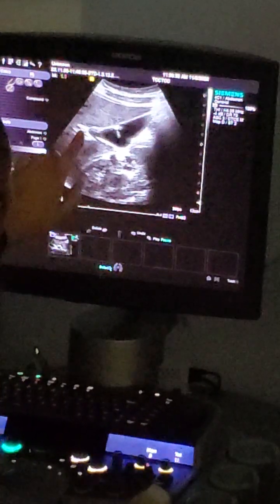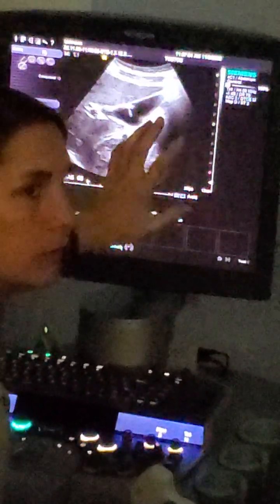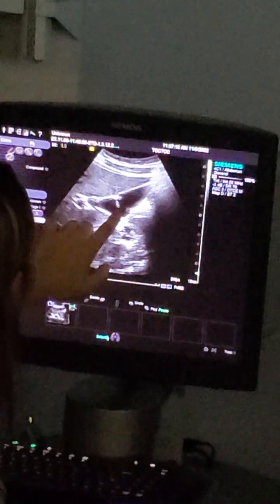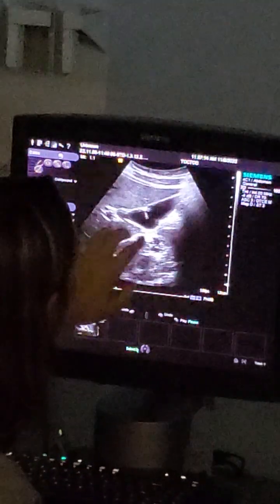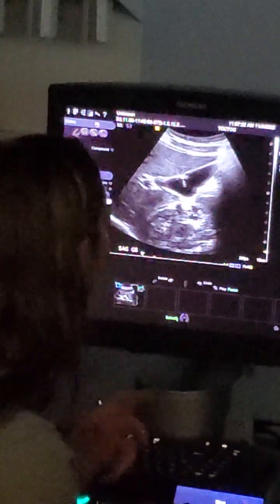So we've got right portal here, not really seeing the main lobar fissure very well. Neck in here, we've got a little fold, which is called Hartmann's pouch. And then we got our fundus up in here. Not very clean. So if this was my patient out in the real world, I would want an image showing that neck and body really clean, and then a second image showing that body to fundus really clean. So we can clean it out.